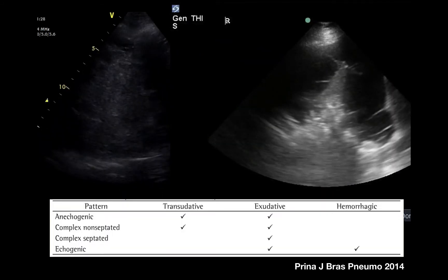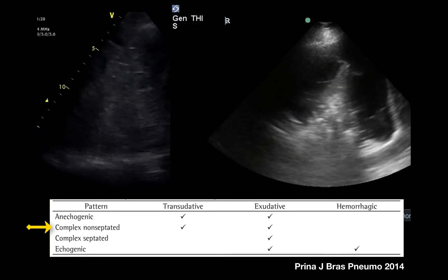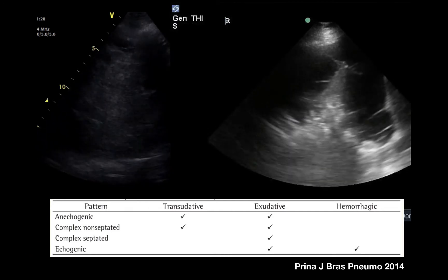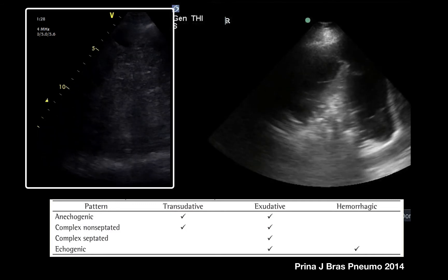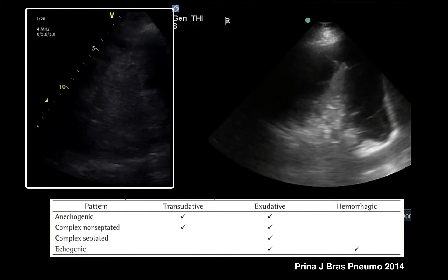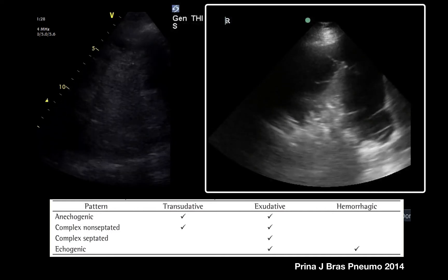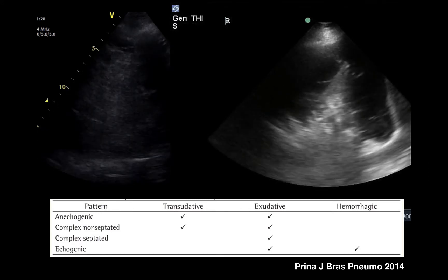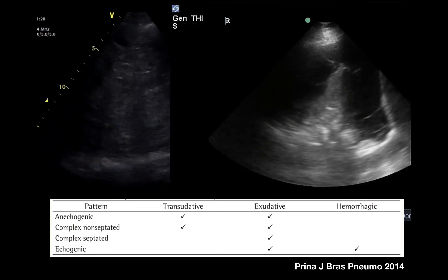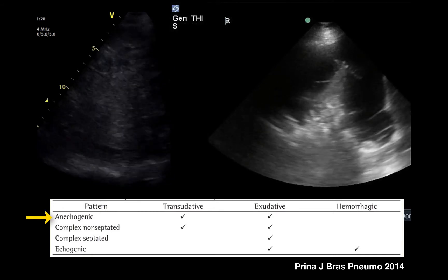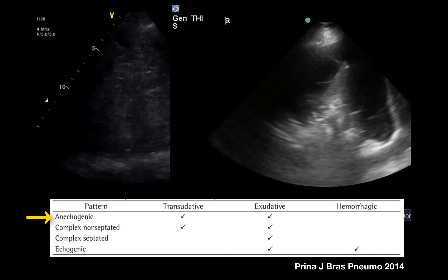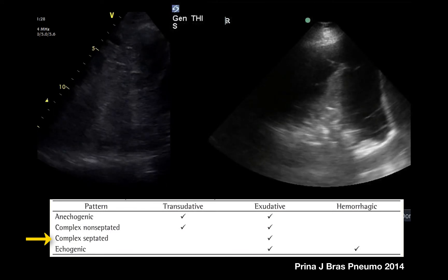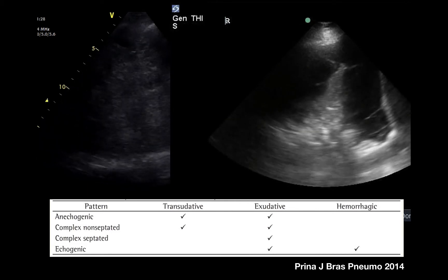There are four major patterns of effusion based on their echogenicity: an anechogenic pattern, a complex non-septated pattern, a complex septated pattern, and an echogenic pattern. On the left, an echogenic structure likely represents a hemorrhagic pleural effusion. On the right, a complex septated or non-septated pattern is shown. These patterns can help guide you to the etiology — an anechoic pattern will most likely be transudative, while a complex septated or echogenic pattern usually represents an exudative or hemorrhagic pattern. This must be interpreted in clinical context; a patient with fever and such an image warrants sampling to rule out an infected collection.